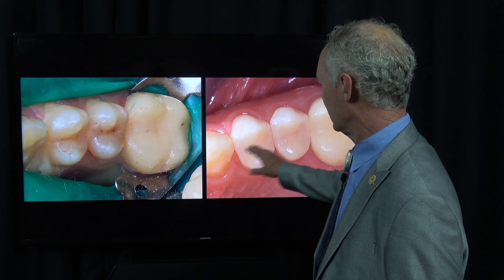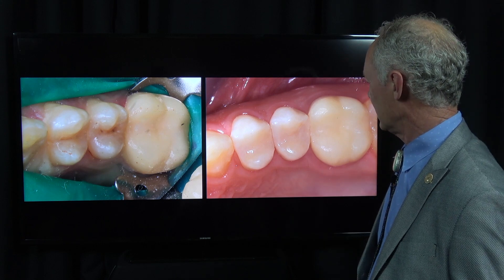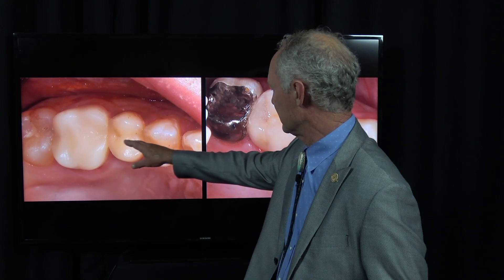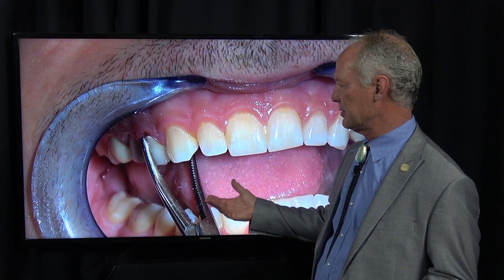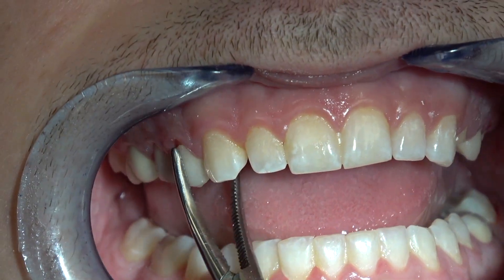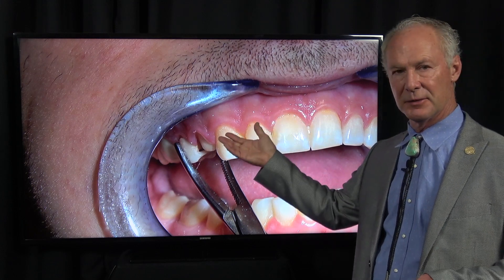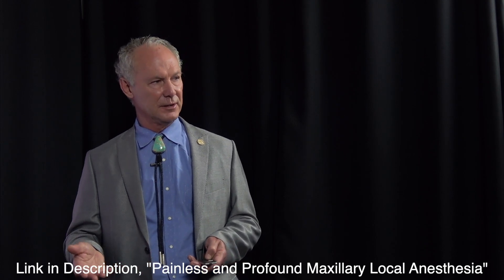You'll see that blood shining through if it's a tooth-colored restoration. This is before and after these two restorations on the patient's right side, and before and after these four restorations on the patient's left side. We're removing the provisional restorations. I won't be talking about crown preps or impression taking in this video — just about seating the final restorations. If the teeth are sensitive, you'll want to anesthetize them ahead of time. We've got several videos on painless and profound local anesthesia in the library.